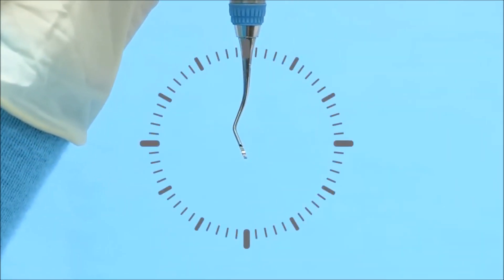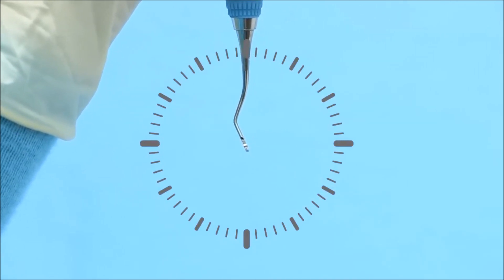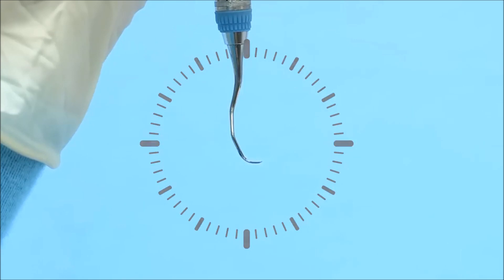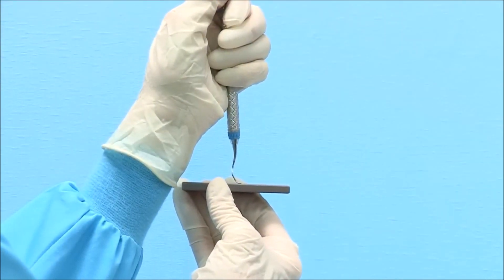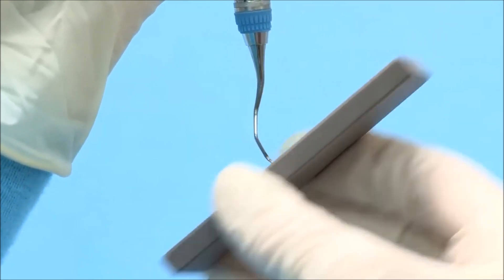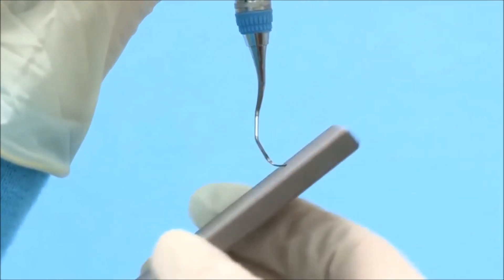To round the toe of the odd-numbered Gracie Curette, maintain the terminal shank at 3 minutes before 12 o'clock. Slowly rotate the instrument handle so that the toe is directed at the 3 o'clock position. The face of the instrument should be parallel to the table surface. Position the stone at 3 o'clock and tilt the stone upward to the 2 o'clock position. Move the stone in a consistent motion overlapping the strokes and rotating around the toe to maintain the rounded shape.